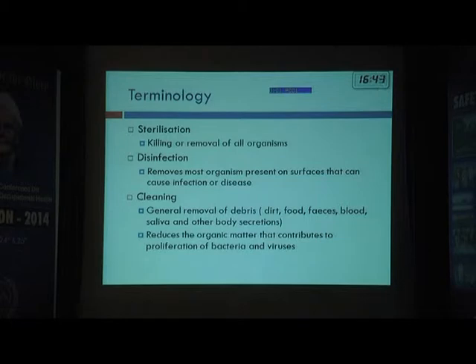And for anything like sterilization and disinfection, you cannot do without cleaning. So you'll have to clean, take out the blood or any organic material that is there from the surface or on the equipment with soap and water before you use the disinfectant or the sterilizing method, because you cannot penetrate through organic matter like blood or body fluids.